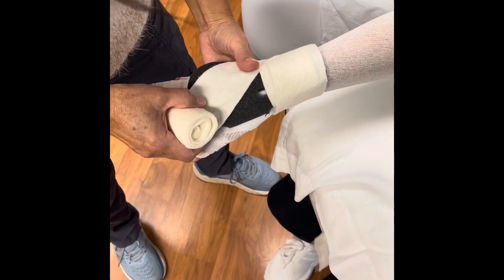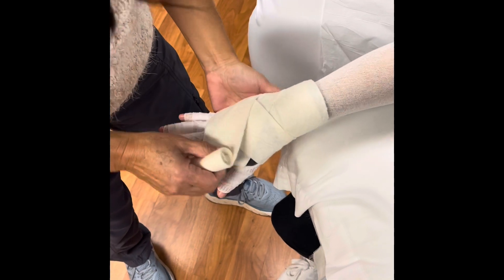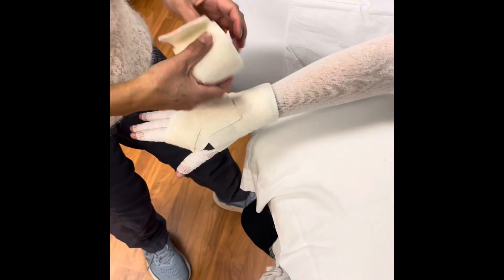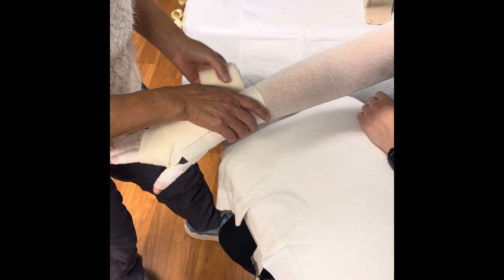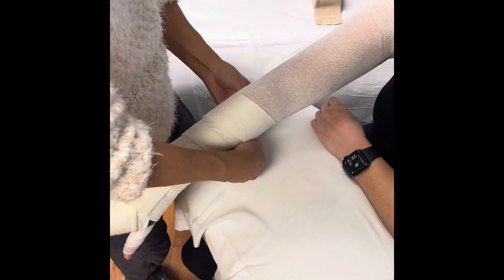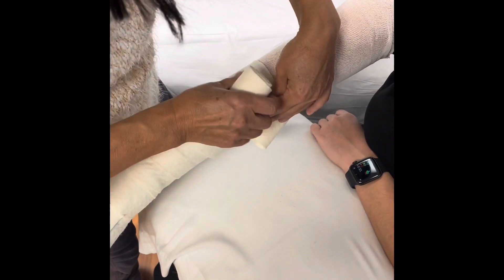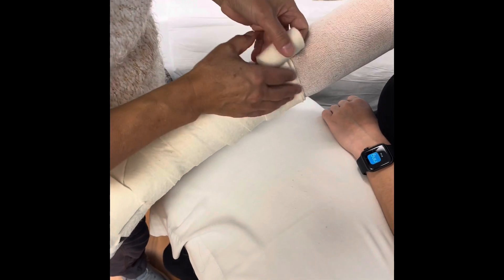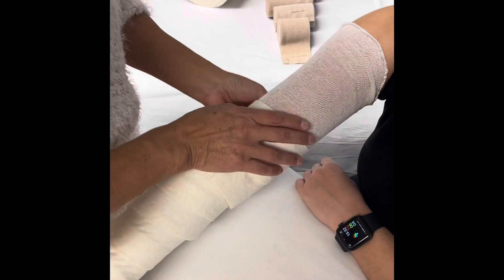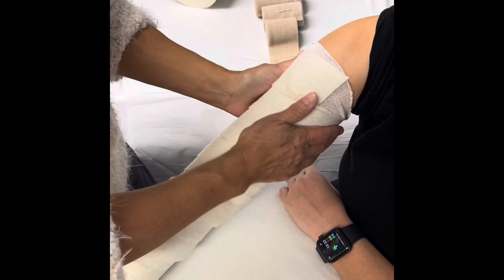We bring it back around — spread your fingers — and that has been stabilized. Then we use the rest of the cotton batting going all the way up, without putting any tension. There are many different types of cotton battings from different companies. Here at the elbow where there is flexion, we can double it up so there is less stop. We go all the way up to the very top to make sure it's all covered, tuck it in, and now she is ready for the bandages.